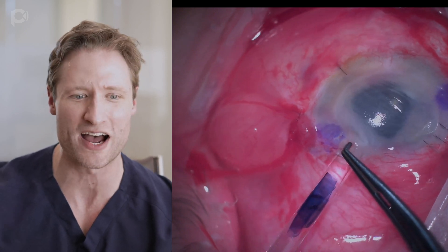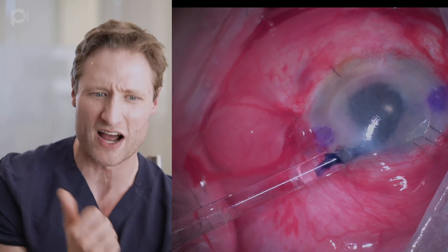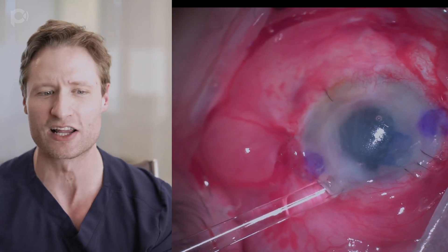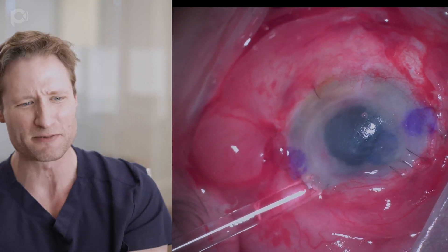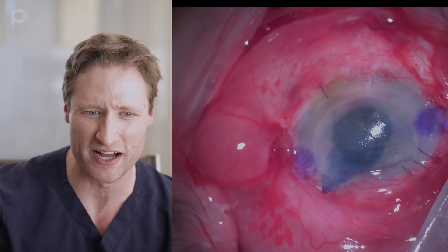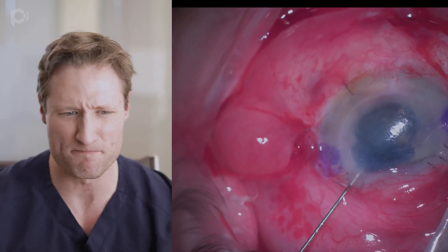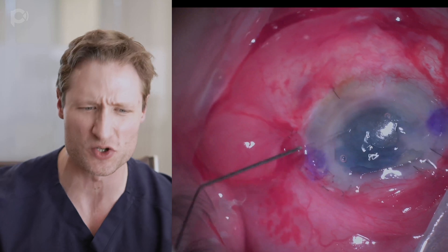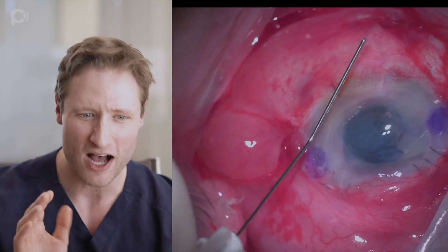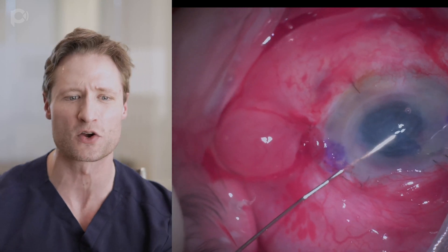Here we go — we'll inject the graft. I'm avoiding the pupillary aperture, pointing the graft away and injecting it into the angle so I don't accidentally lose it into the back of the eye. The graft still wants to reflux out of the eye because of all this fibrotic tissue around the patient's iris remnants, but that's okay. I just poke the graft back into the eye, put a little fluid, and do a few subtle taps on the surface of the cornea.